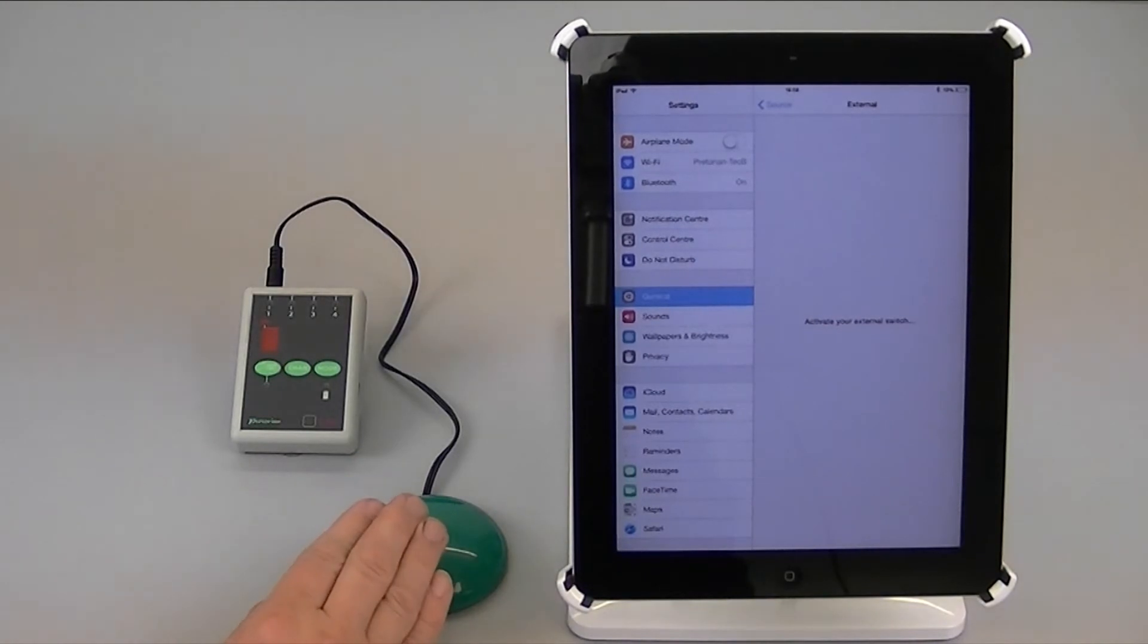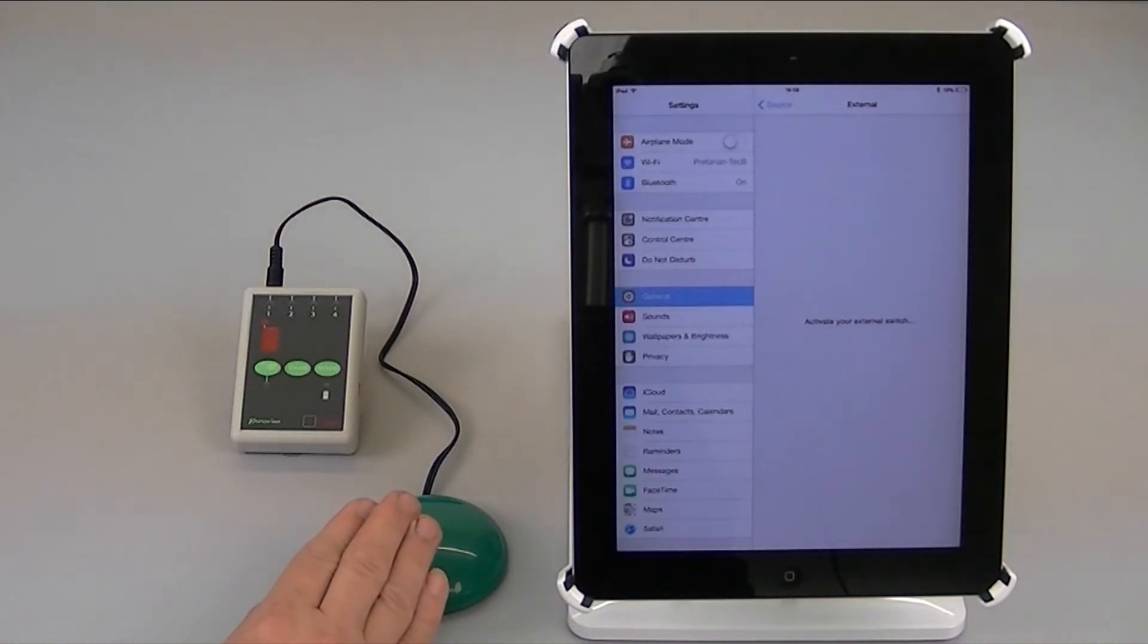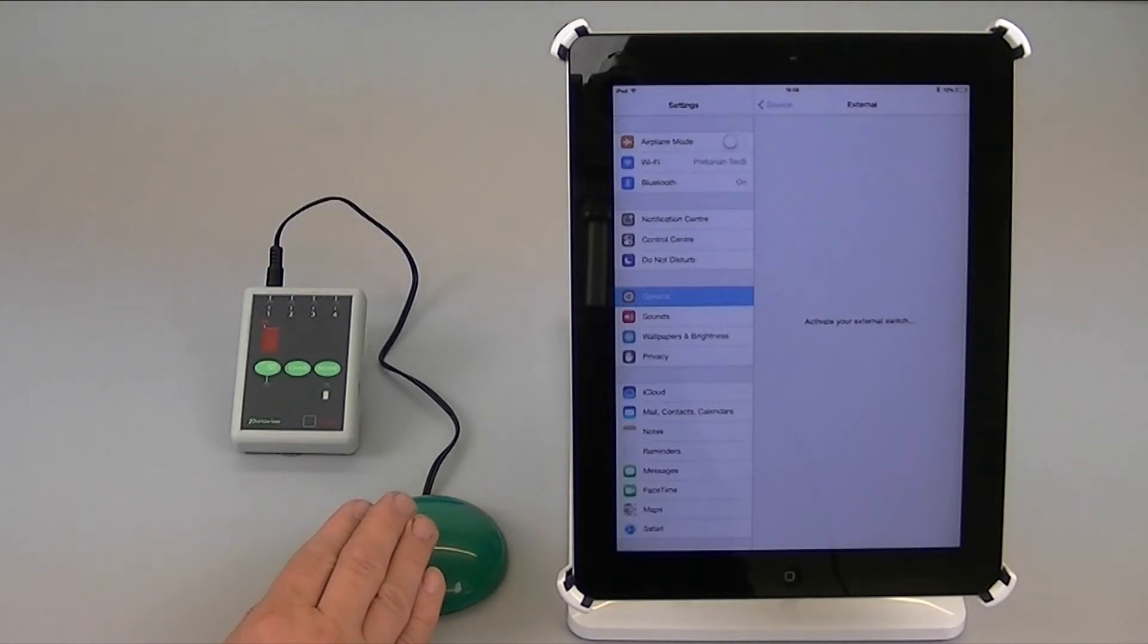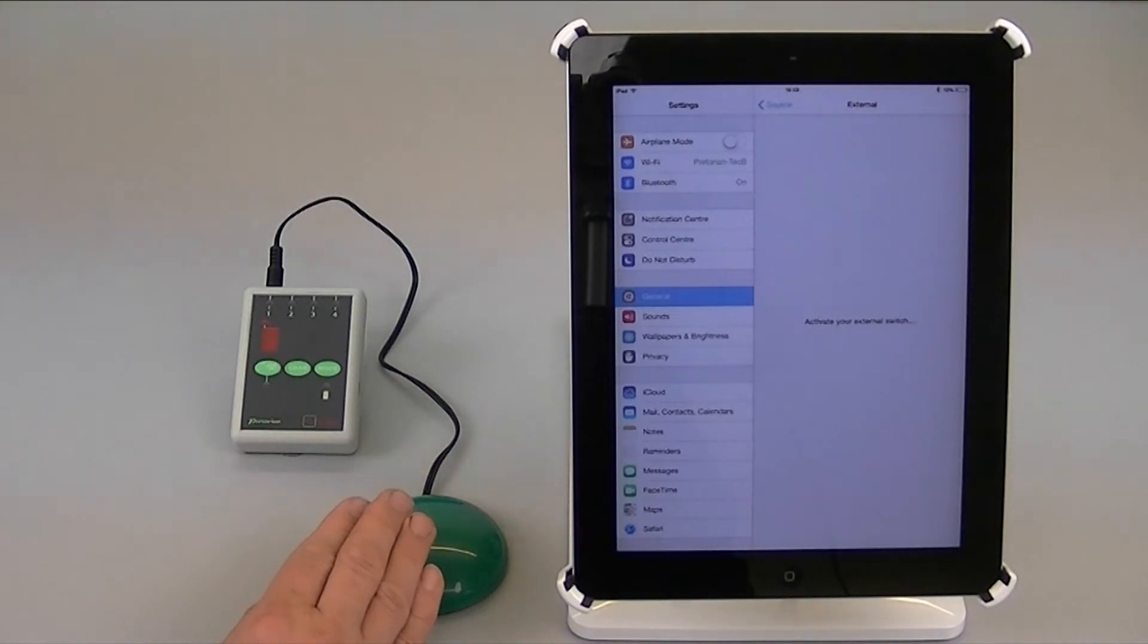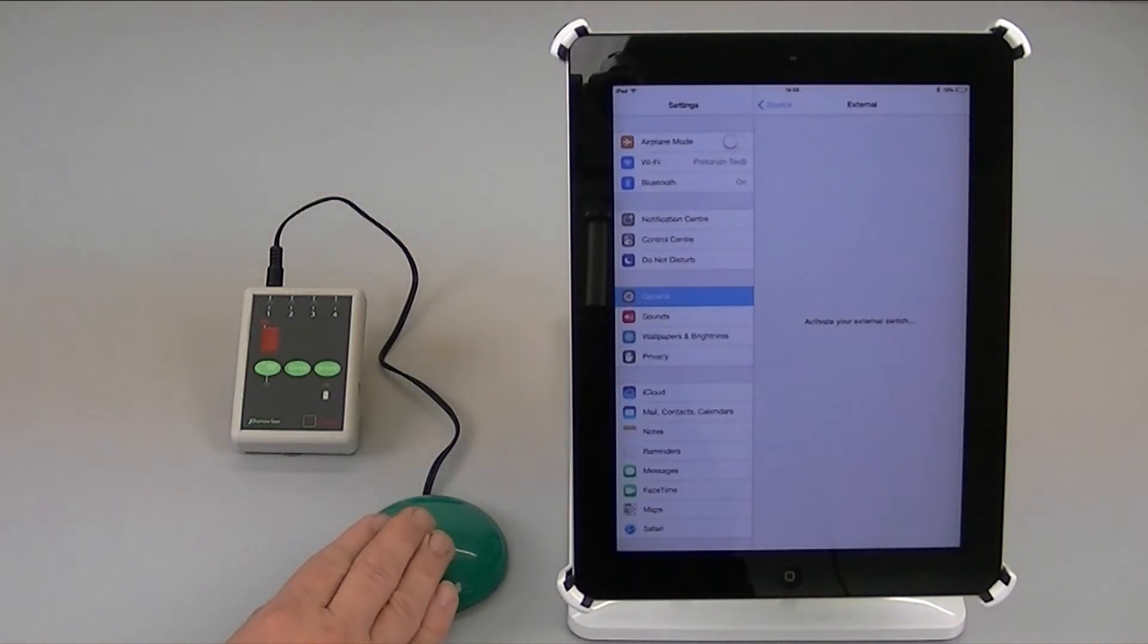It's very important that you only press it briefly because it's the enter function we want to set up and not the home. The home function is intuitive, it's understood by the iPad already so we don't need to configure it. Only the enter function.